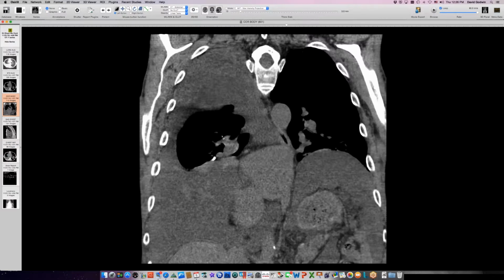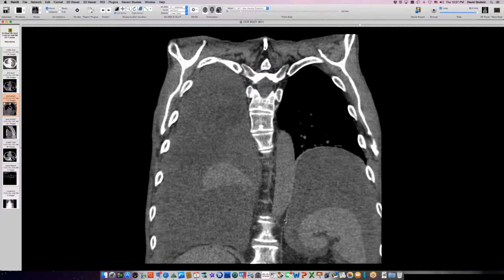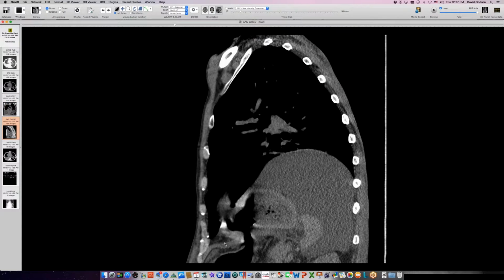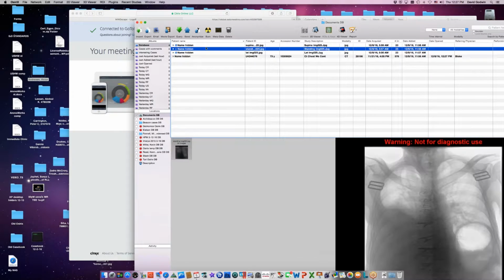Although he's got thin diaphragm tissue at this level down here, it looks very wispy and would definitely make you think that this could be atrophied. If we look at a sagittal view, we will see that anteriorly he's got quite good thickness of his diaphragm muscle. So this predicted to me that this was, despite the elevation, not going to be paralysis. But we were asked to do the fluoroscopy of his diaphragm anyway, so I'll start with him standing here.